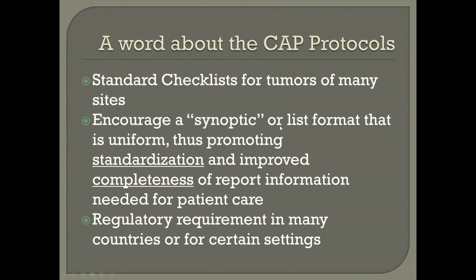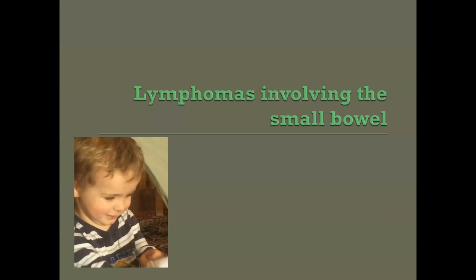By using a synoptic list or format, they promote standardization and completeness of the report, and that's been demonstrated in study after study. In some locations, regulatory requirements may actually require the use of these checklists to ensure high-quality patient care. If you're an accredited laboratory by the CAP, well, you've got to use these as well for a demonstrated majority of your patients. Well, let's talk about lymphomas involving the small bowel after we look at this cute little boy here.